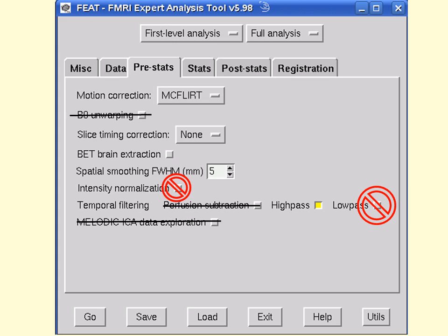And one of the reasons that's a bad idea is because actually there can be meaningful fluctuations in overall average image intensity, which are due to functional activation that you're actually trying to detect. So you don't want to squash those differences due to variation in the bold signal by forcing every image to have the same mean intensity across voxels.